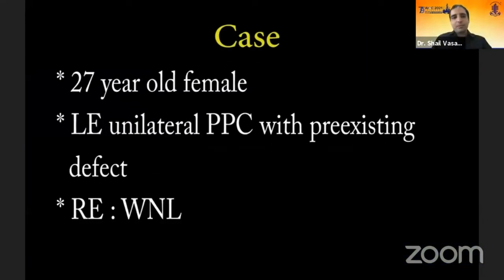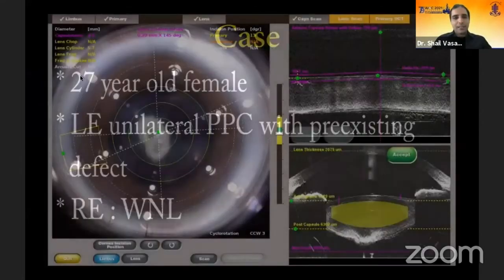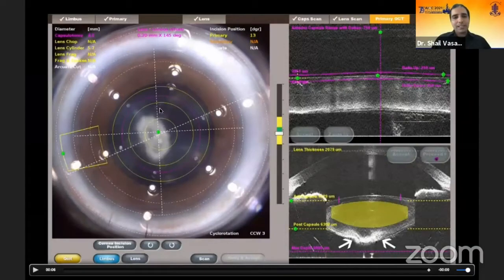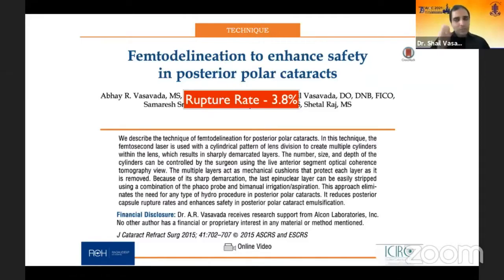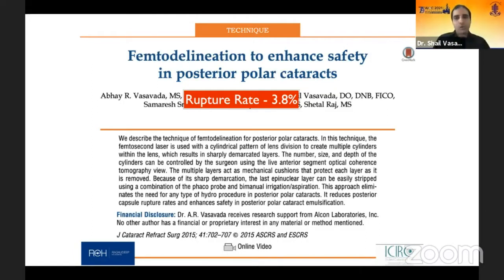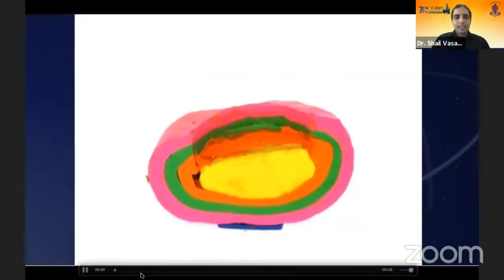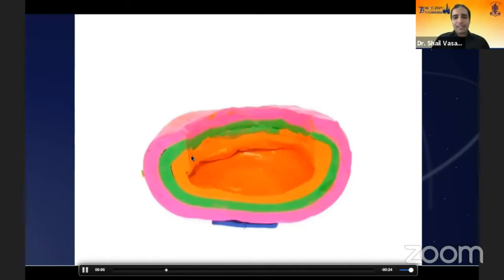This was a 27-year-old female with a unilateral posterior polar cataract and pre-existing defect. We prefer femtosecond cataract surgery in such situations with a central cylindrical lens division pattern. We published this back in 2014-15, where we found that femtosecond delineation without any hydro procedures helped reduce our rupture rates.